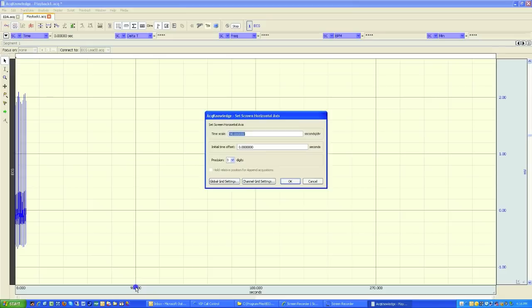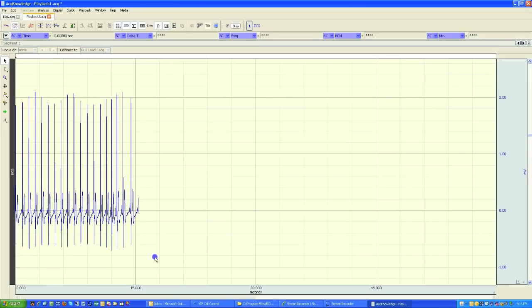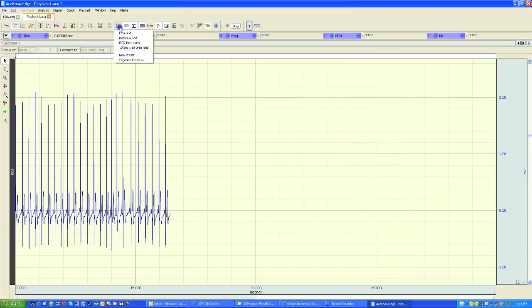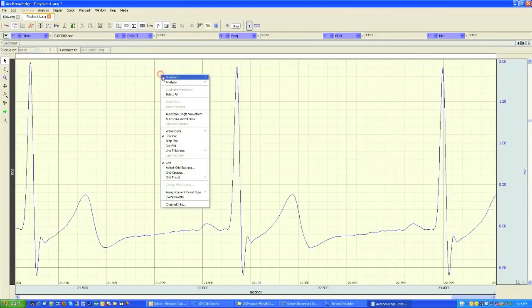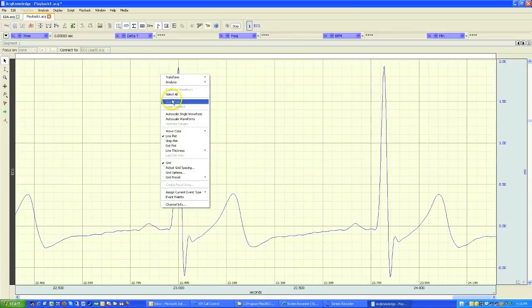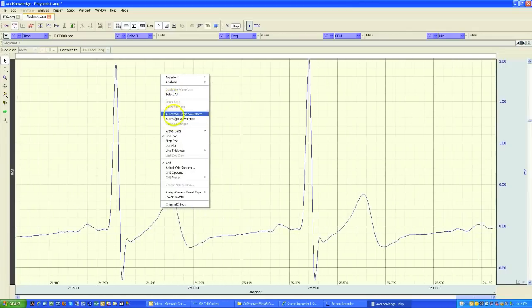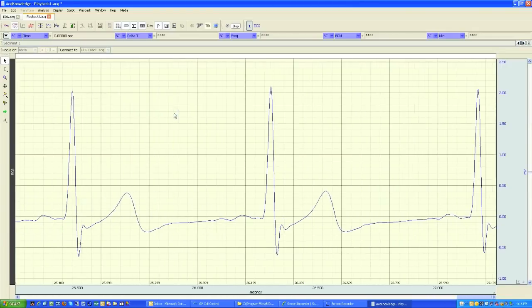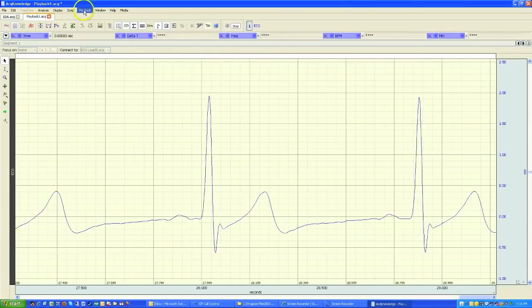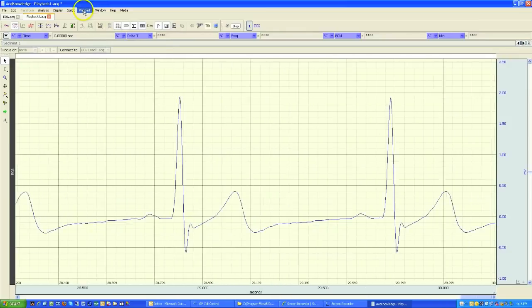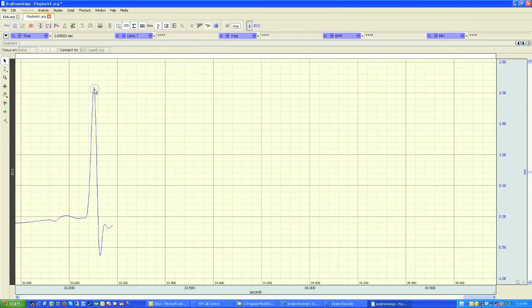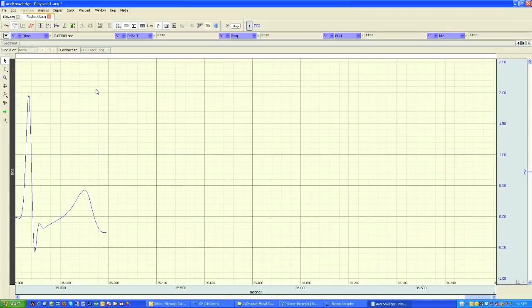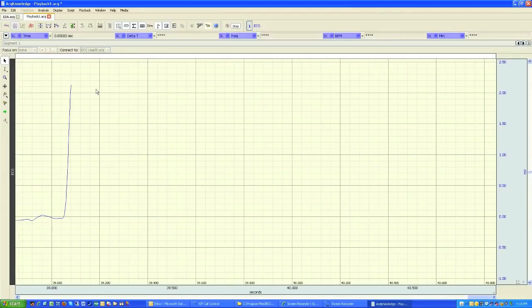But of course I can come in and make some changes. So I've just adjusted my horizontal scaling. I can add a different grid. I've got some grid options, add the ECG grid. And I'm going to auto scale my waveform. I can change it so that we're going to turn off the scrolling. So now it's just refreshing every time.